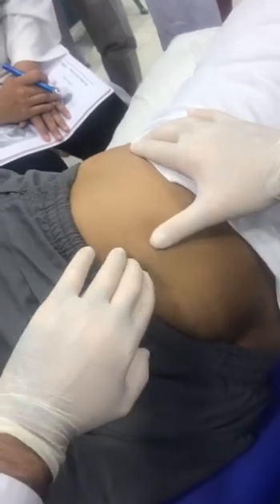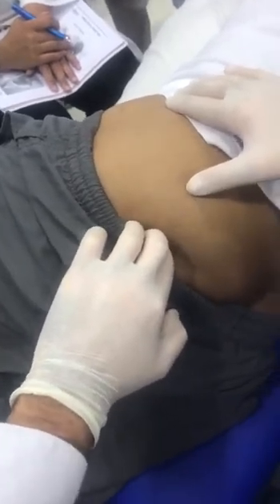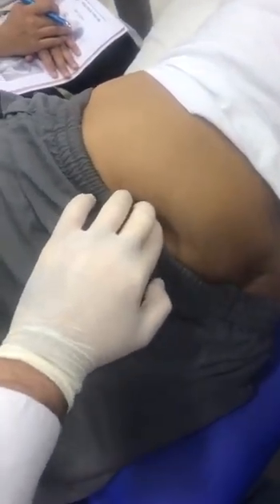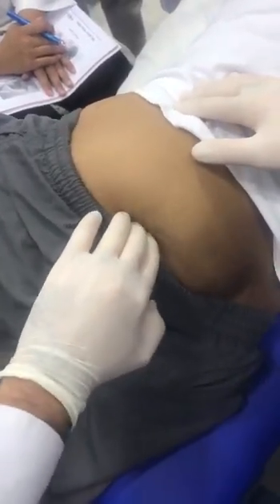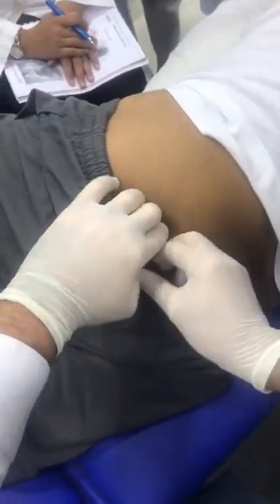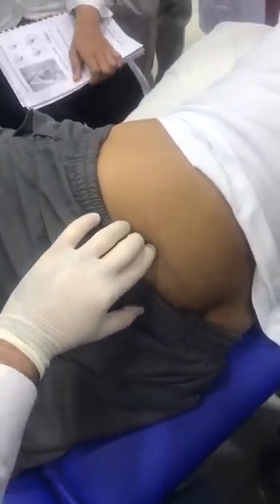Yeah, this one. This is the sulcus, so all this, perhaps. What about this? I feel this is not a direct palpation, but you feel something stiffer there. Better. Well, sulcus. I think we can try here. Trigger points, what do you think? Feel it full of trigger points. Whenever you put your hand, it's tense. Okay, we are going to do just here.